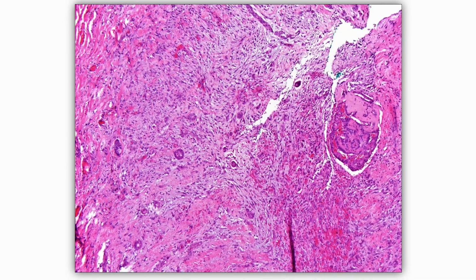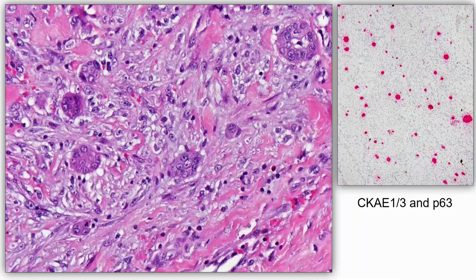But there were these epithelial elements here in this very cellular stroma, and it looks a bit atypical. They did a keratin and p63 cocktail, and you can see no p63 staining. So this was actually called invasive ductal carcinoma. It went to the edge of the specimen, so the patient had a re-excision and a sentinel lymph node biopsy. So it's really, really important to think about displaced epithelium, recognize biopsy site stroma, and that it's not desmoplasia.